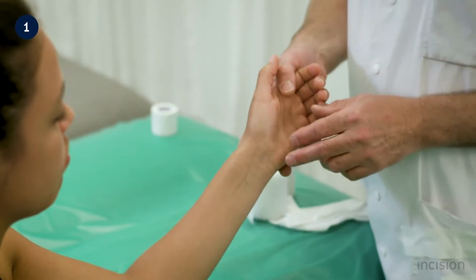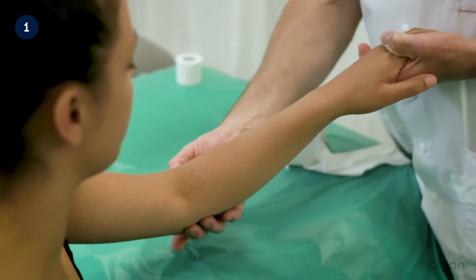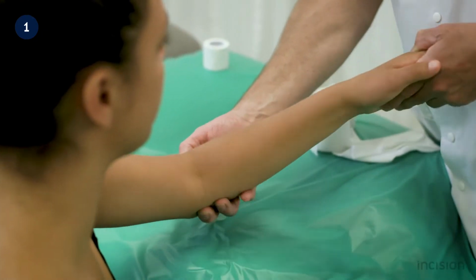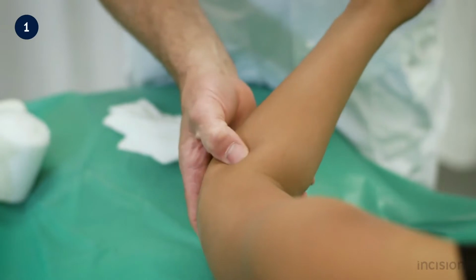Before starting the application, the arm is examined. Injuries to the wrist may be accompanied by elbow injuries. The elbow is examined for mobility and the head of the radius and the ulna are palpated to test for tenderness.